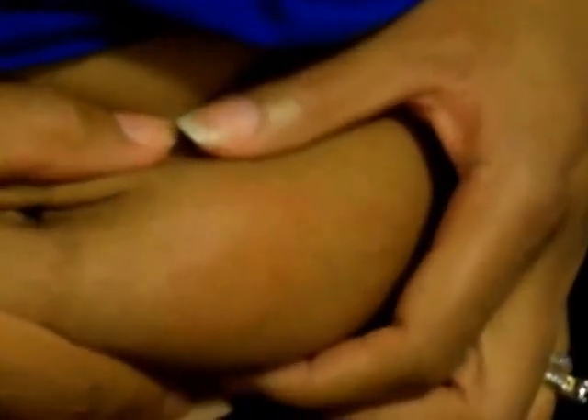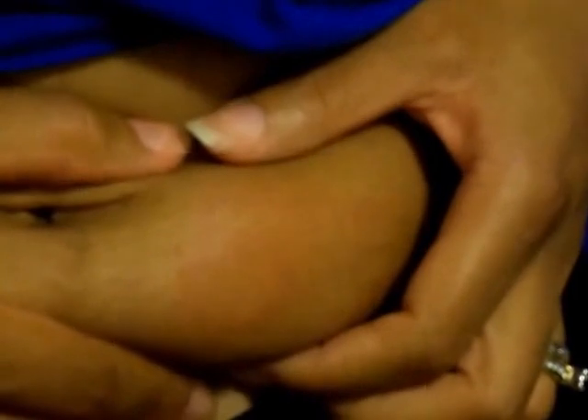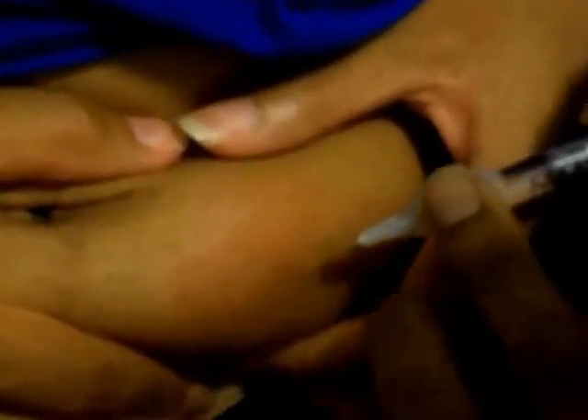What you want to do is pinch your belly like this to do the injection. That way you're able to get the liquid into the fatty area. One, two, three.